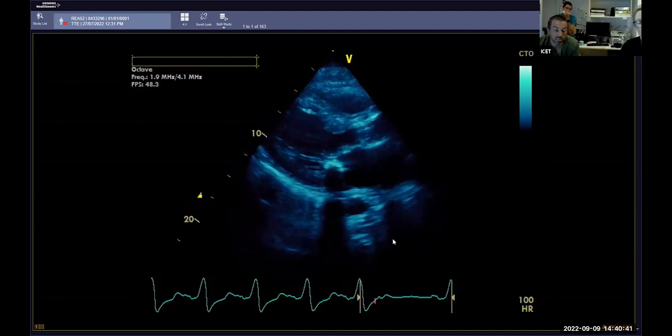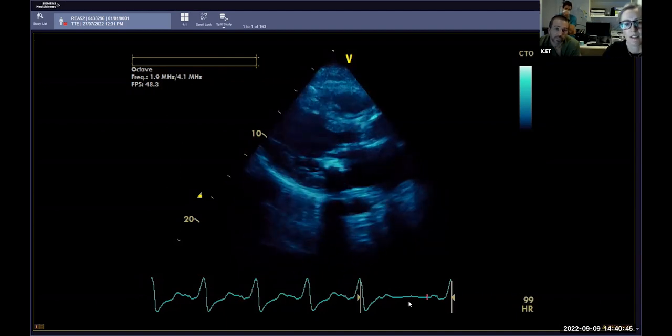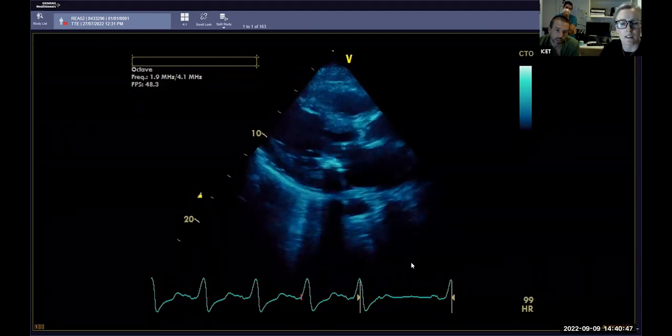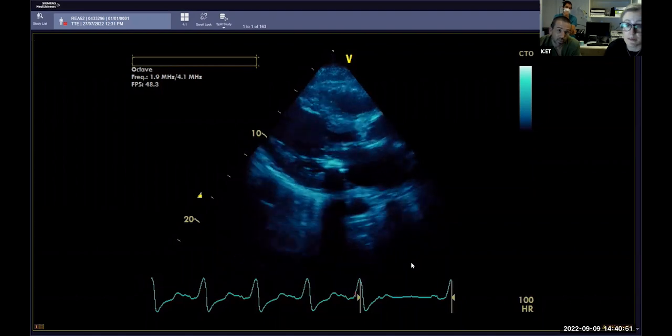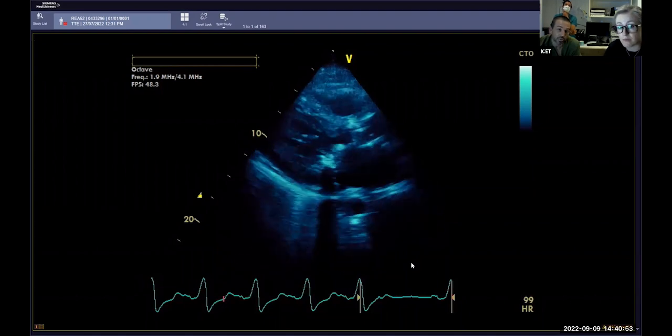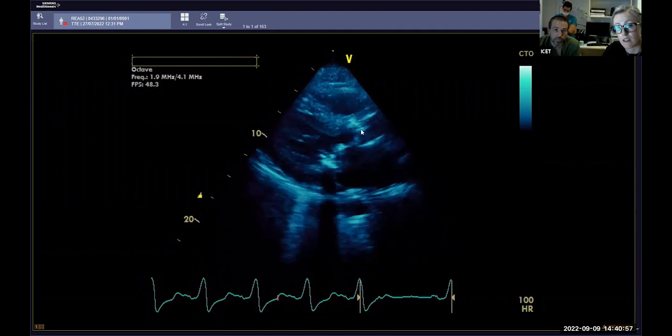I don't know why she has that. That can be hypertension. It can be an infiltrative disease, of course. Diabetes. And diabetes, right? So the overall contractile function of the left ventricle is probably mildly down so far. But as I said before, you might be out of the room. I am worried about the extent of calcification around her aortic and mitral valve.